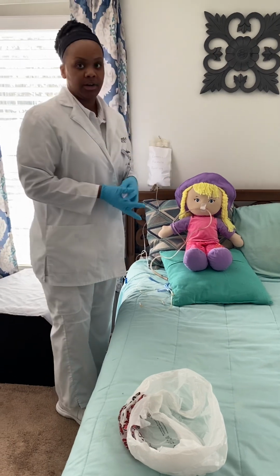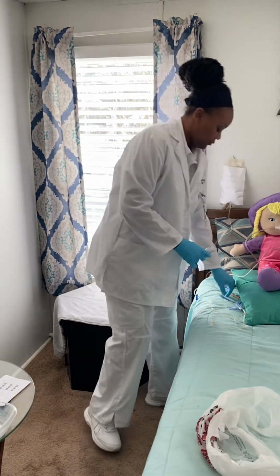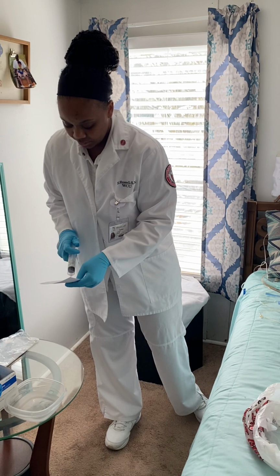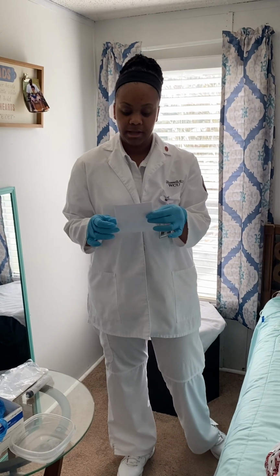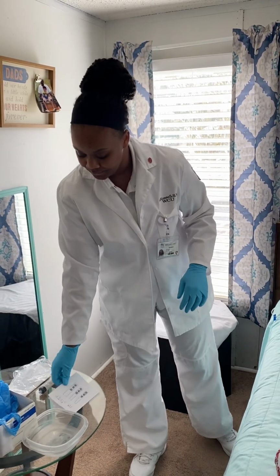And at this point, I'm going to be checking for gastric content, or checking for the pH. So I'm pulling up gastric content, placing it on my pH strip. Here's my pH strip there. And it's showing a pH of 2. The color consistency is about a color of green.